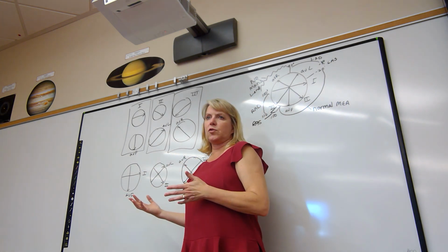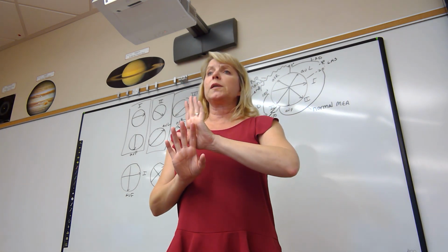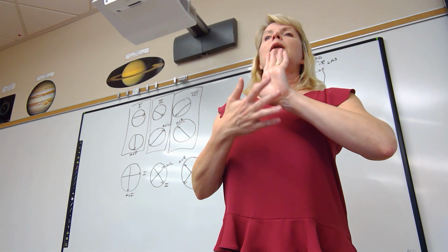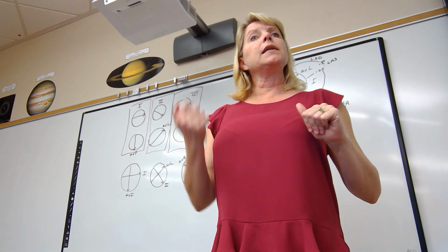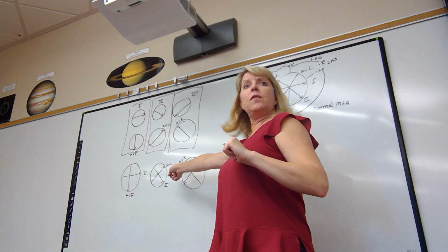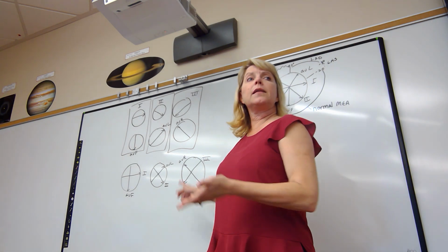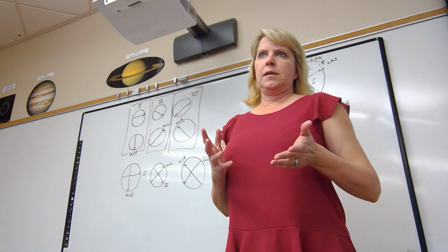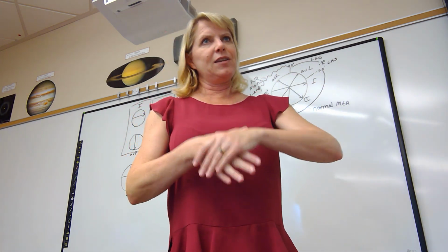Those are the combinations. So Stephanie, you might get the test version where it says compare lead 1 and AVF. Tell me the patient's MEA. Ashley, you might get lead 2 and AVL. Carlos, you might get lead 3 and AVR. Be ready.